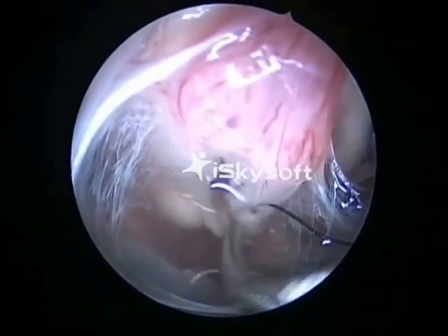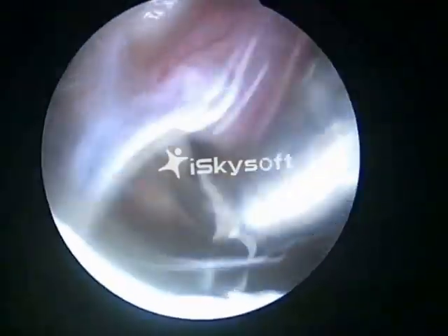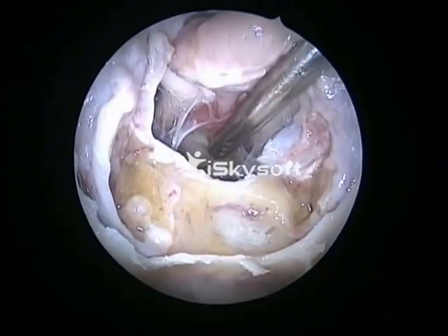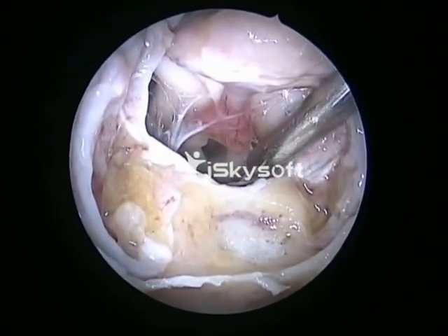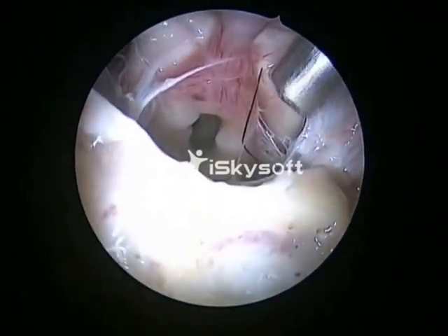Now we'll have a glimpse into the interior of the third ventricle. We are now sucking the CSF. The telescope is advanced inside the third ventricle.